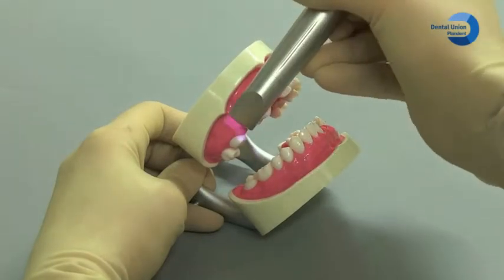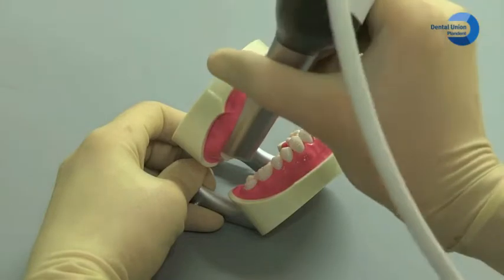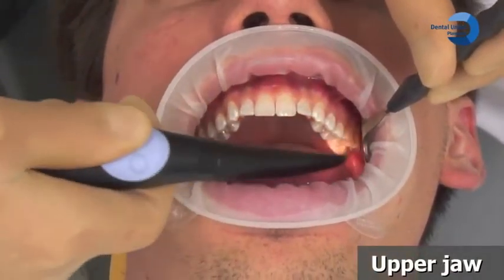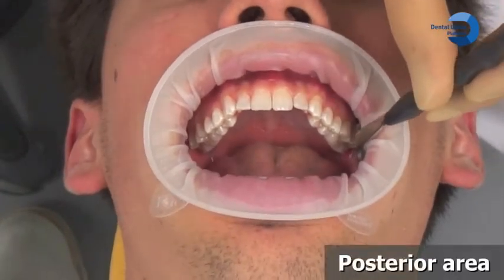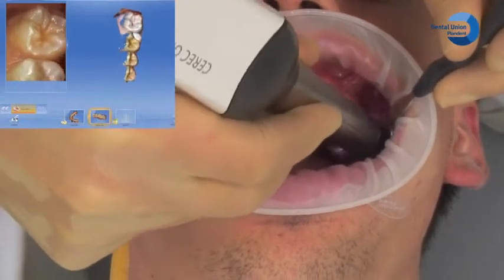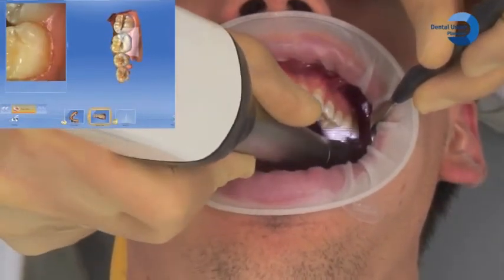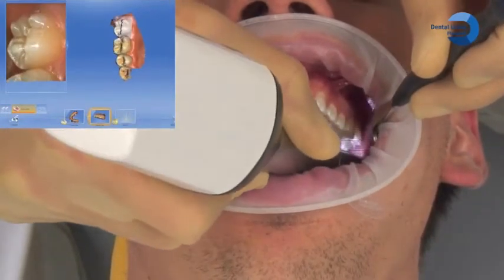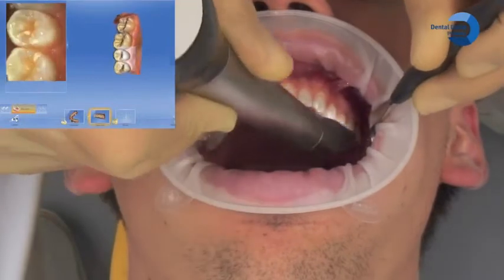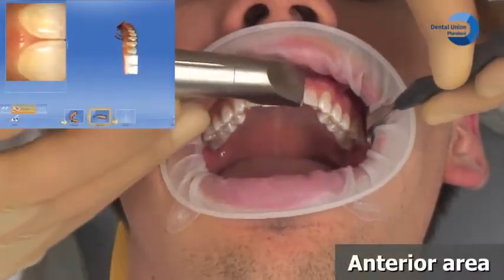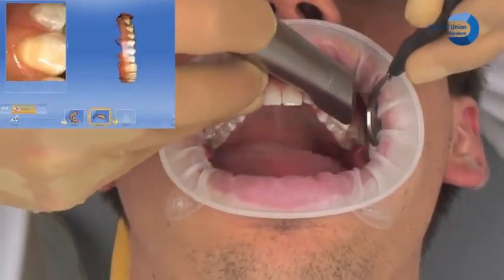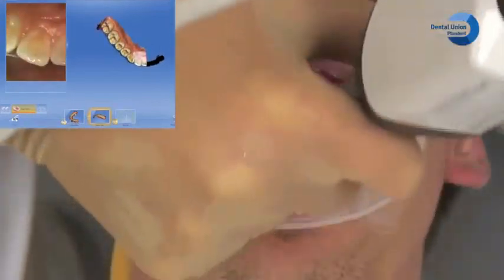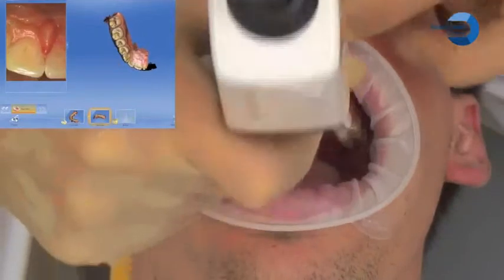Tilt the surface in the distal and mesial direction to gain a better view of the proximal contacts. Just as described for the lower jaw on the model, please now carry out the scanning for the upper jaw. Use the demonstration of the intraoral scanning of the upper jaw to expand your knowledge about the scanning technique.